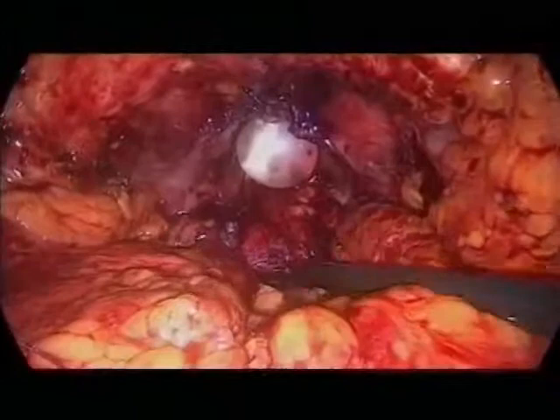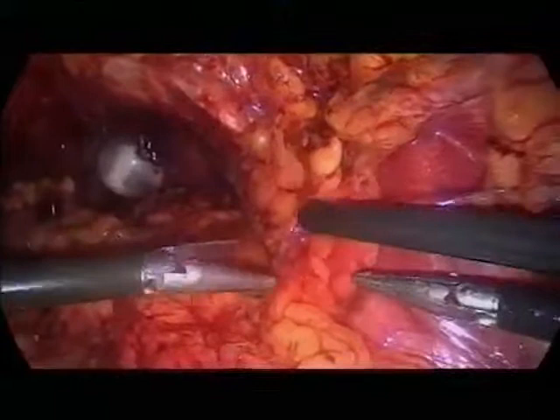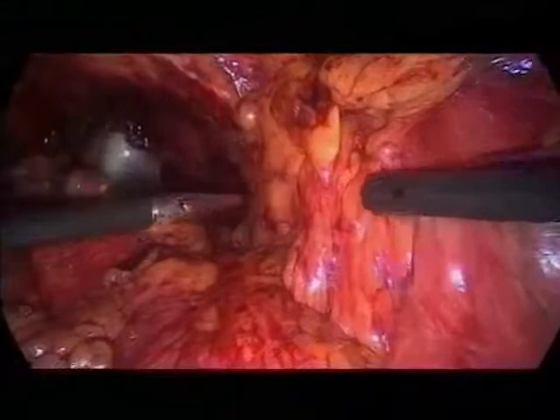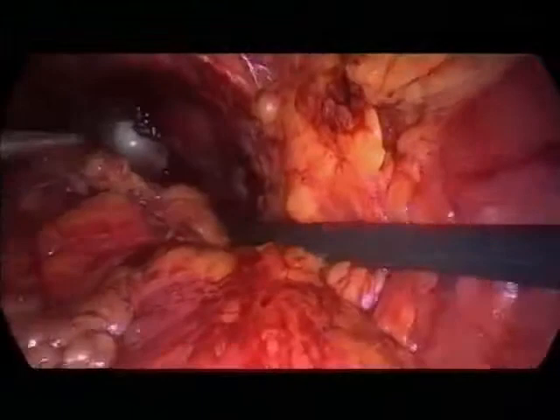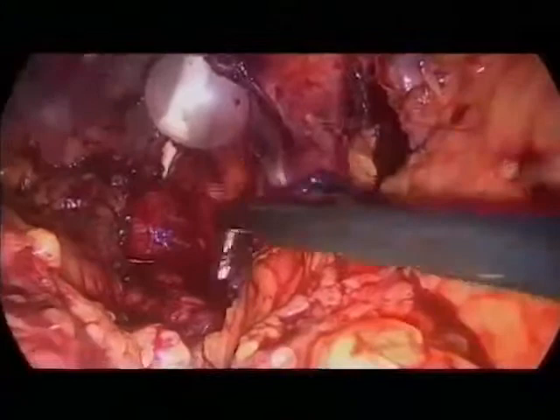Could you comment on the need of a pelvic lymph node dissection in this case? We have indications for lymphadenectomy, and our indications are when the PSA is higher than 10 and or the Gleason score is higher than 6, and then we free the external iliac artery, the internal iliac artery, and the obturator fossa. That's what we do in candidates. But this patient statistically has a risk of 1% as it was presented, so I think there's no need for lymphadenectomy in this patient.